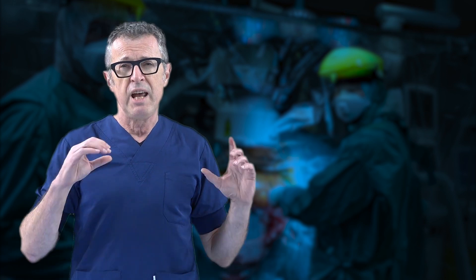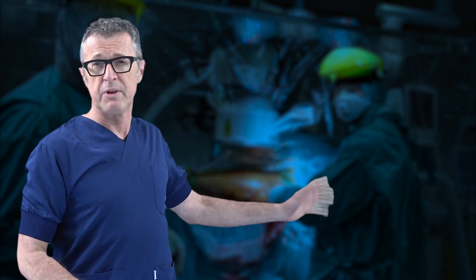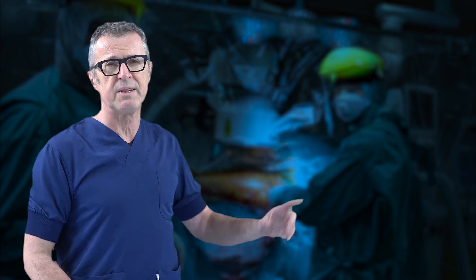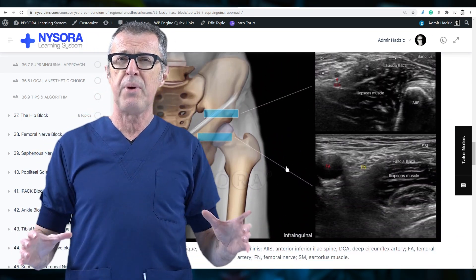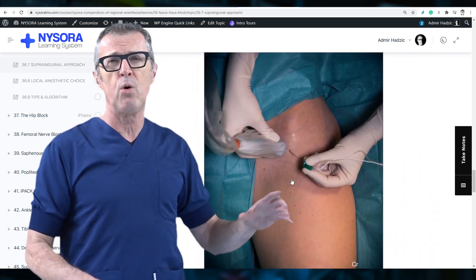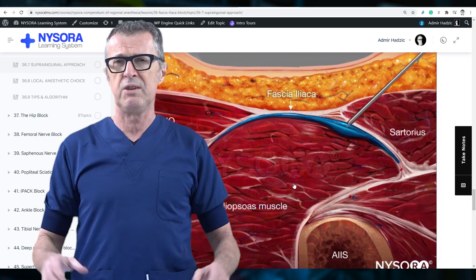In this video, we will watch the anesthetic management of an elderly patient with hip fracture during a teaching session with anesthesia assistants on regional anesthesia rotation. Our goal at NYSORA is to produce generations of anesthesia practitioners skilled in providing standardized, reproducible anesthesia care even for the sickest and most challenging patients. You can read about all the procedures in NYSORA's regional anesthesia LMS. We will briefly describe the suprainguinal fascia iliaca block and paramedial approach to spinal anesthesia, both covered in much greater detail in NYSORA's LMS.